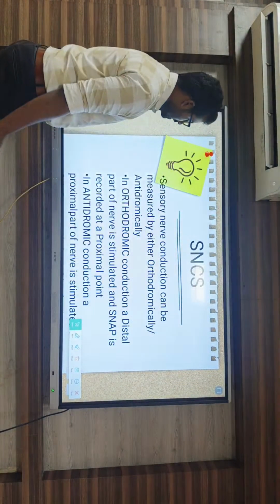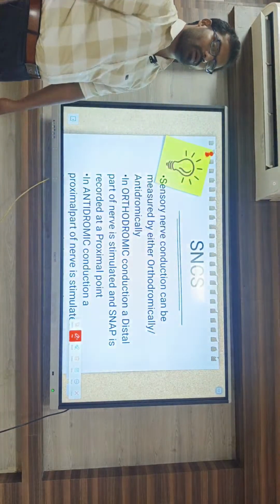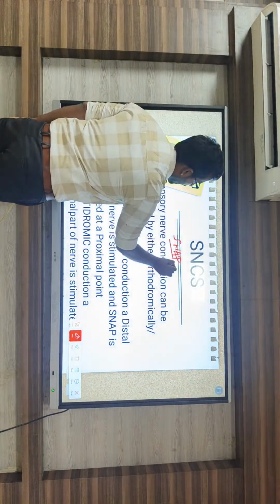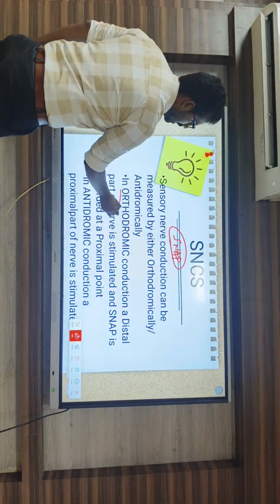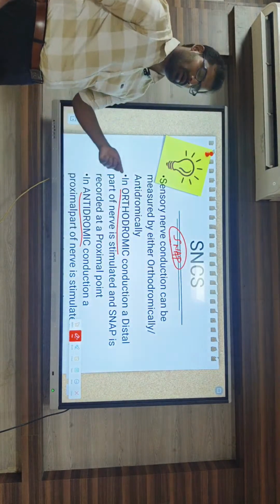So coming to the sensory nerve conduction study. In the sensory nerve conduction, we want to know about the SNAP, sensory nerve action potential. So how are we going to identify the SNAP? That is based on the orthodromic and antidromic manner. So what is antidromic? What is orthodromic?